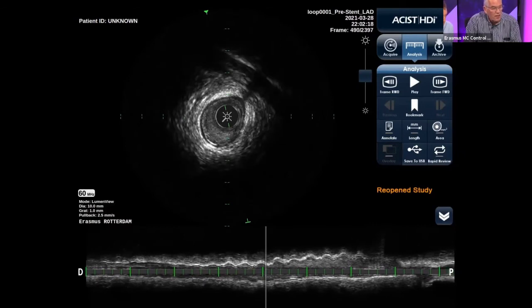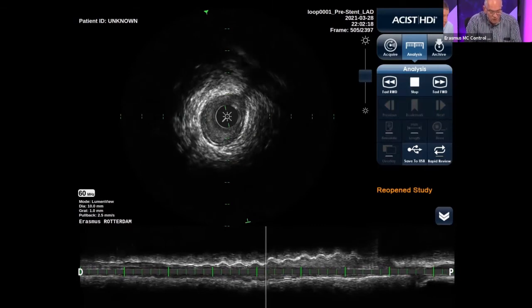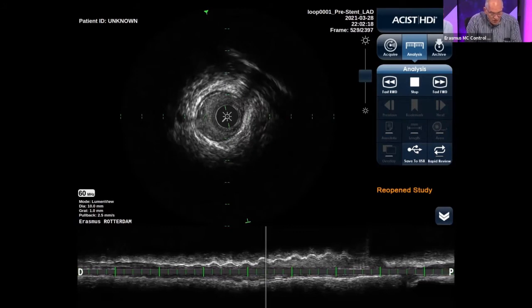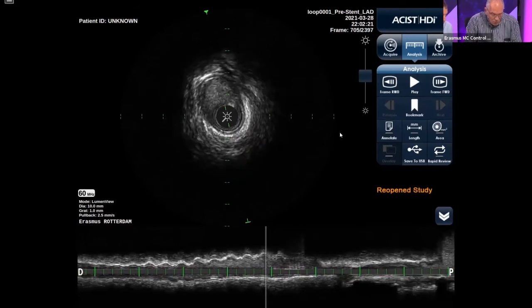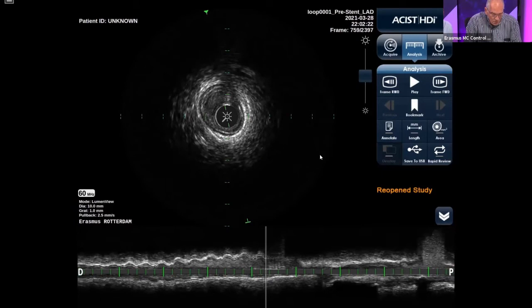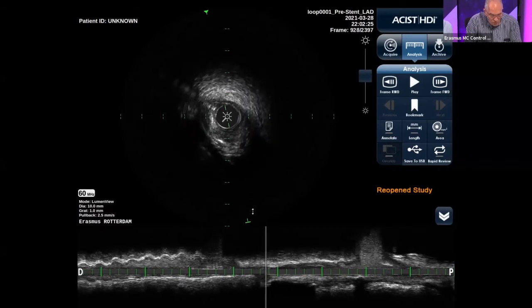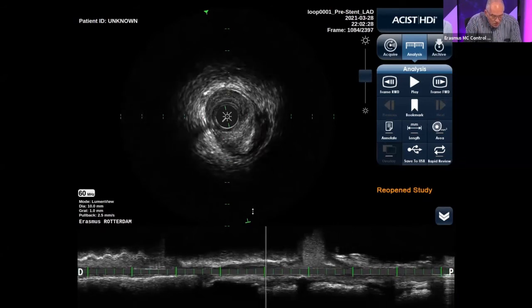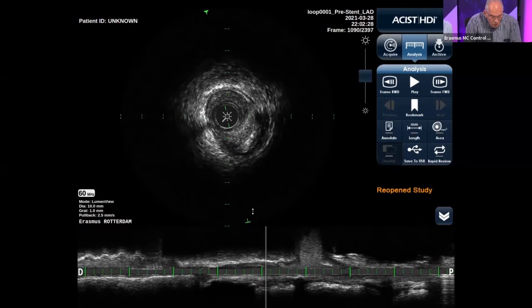and what you also appreciate again in here, and if I put this in movement, then we again have this sluggish flow, this slow flow in there, indicating that somewhere more proximal, in this case, the IVUS catheter is occluding something. So if we go more proximal, then we go in here with a spot with some fibrous tissue, and here we get calcification, and also we reach here the spot where we have the more subacute thrombus.